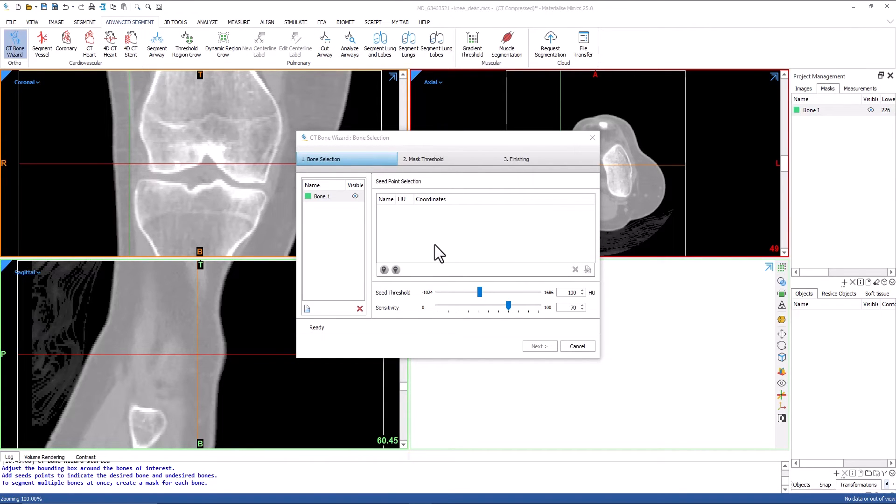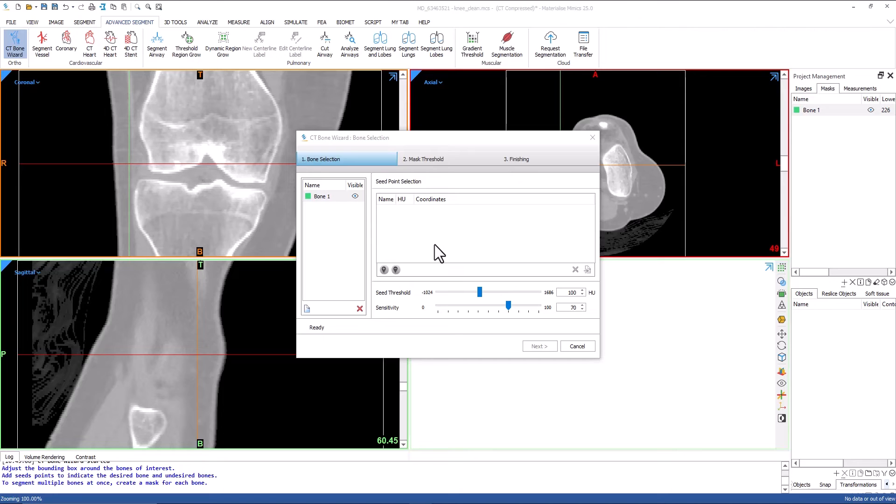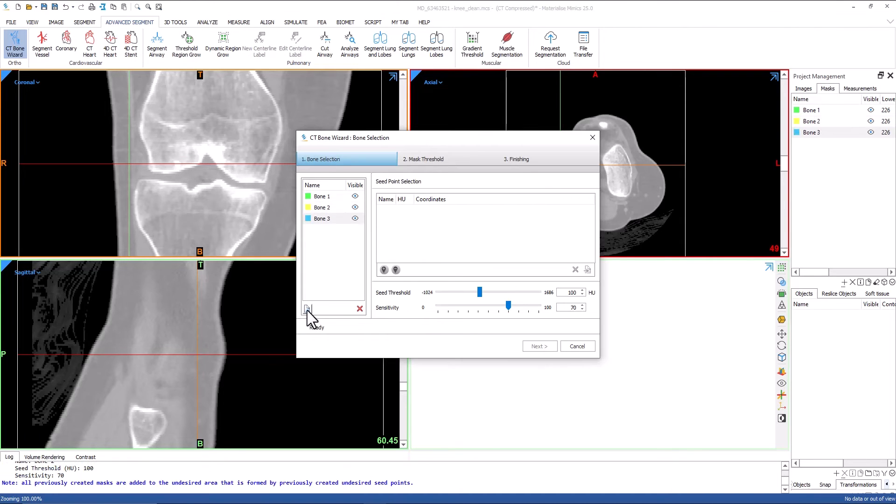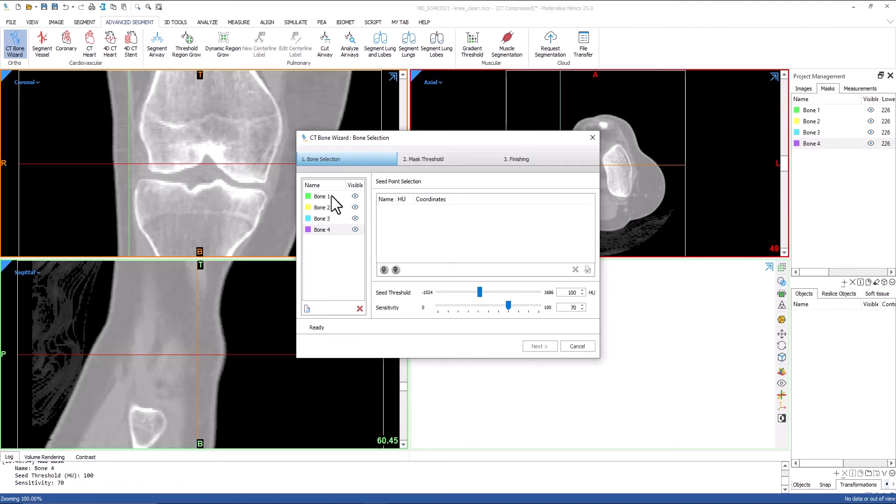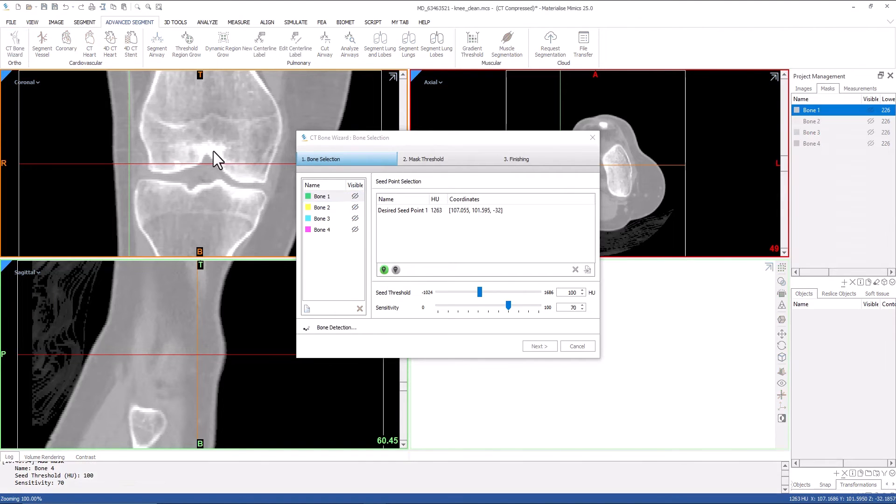The first step of this tool is bone selection. Seed points will be placed within the bone to define the outline or cortex. Multiple bones can be added on this page, and seed points can be added and removed for each one. I will go through and define seed points for the femur, tibia, fibula, and patella now.